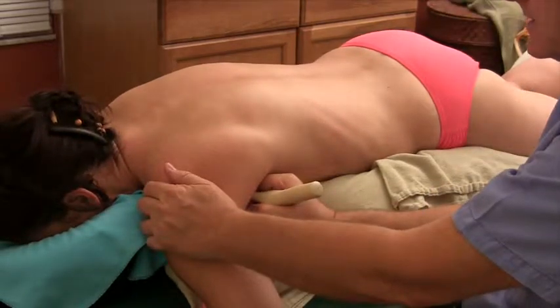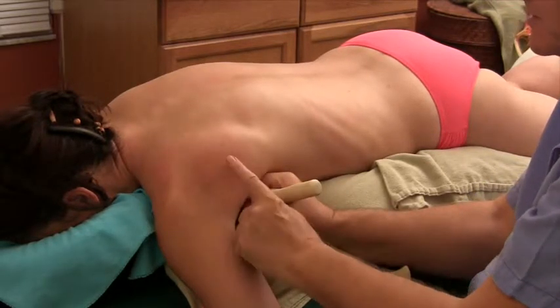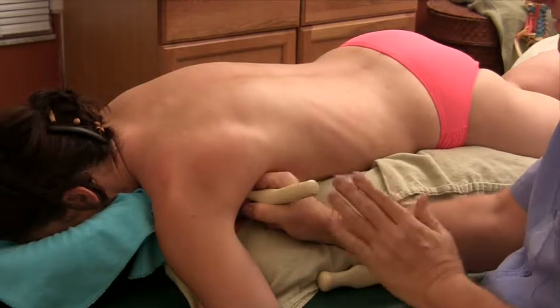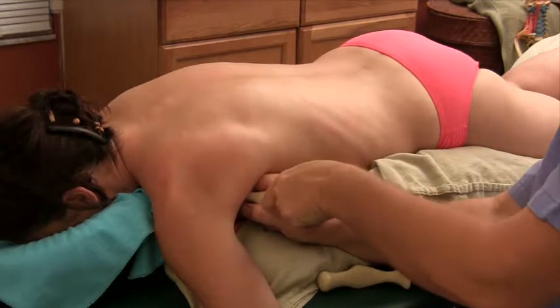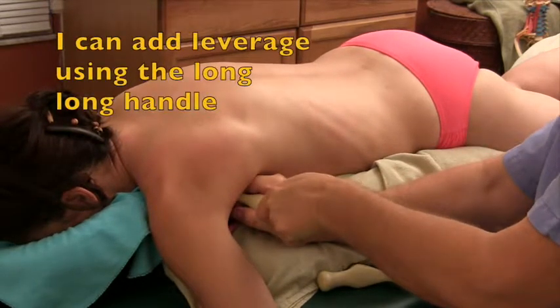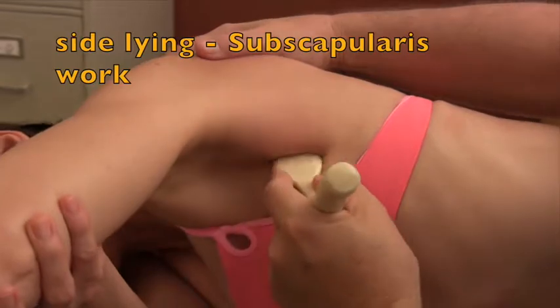So it is my intention to reach up inside here and then push posterior — in other words, directly towards the ceiling in this case, directly into that subscapularis. I've put a long handle on this tool so that I can actually use it as a bit of a fulcrum to push down on the handle, and that will apply more pressure in the subscapularis if the person needs.